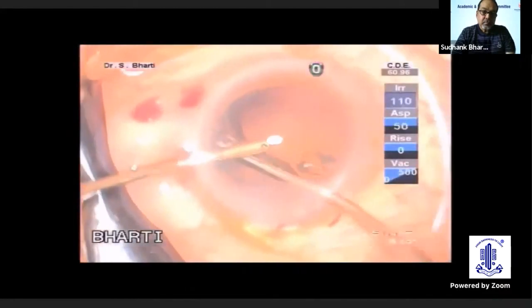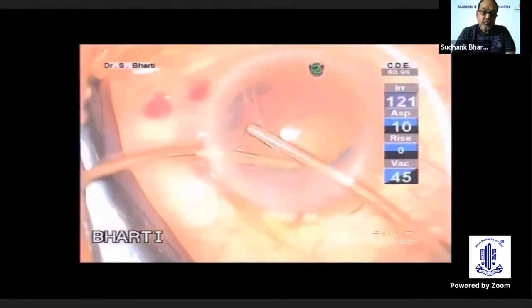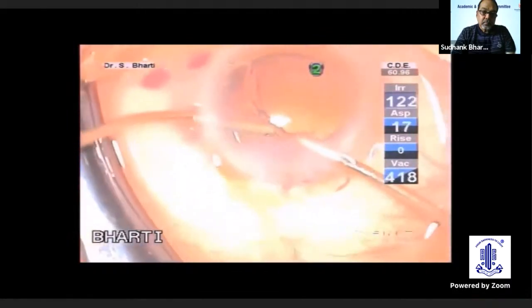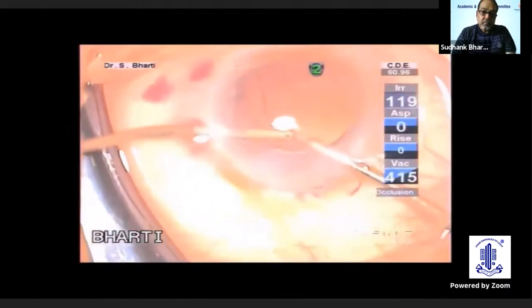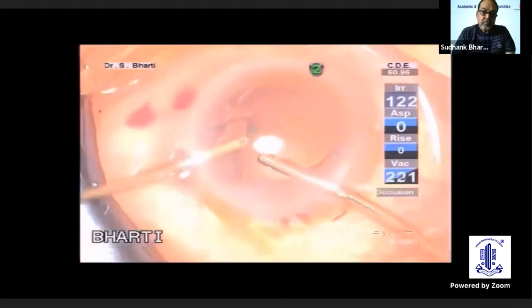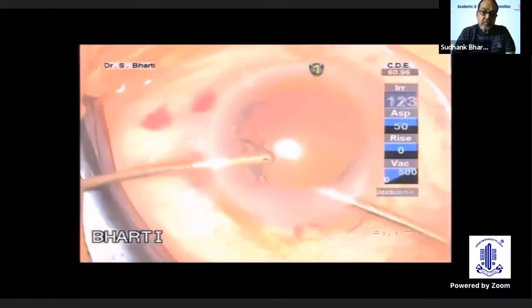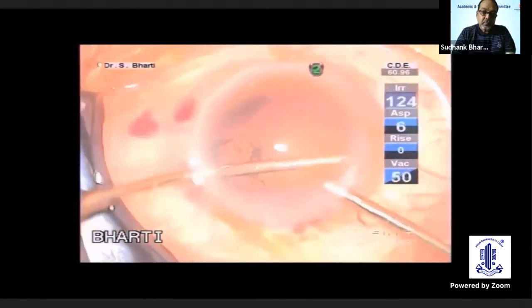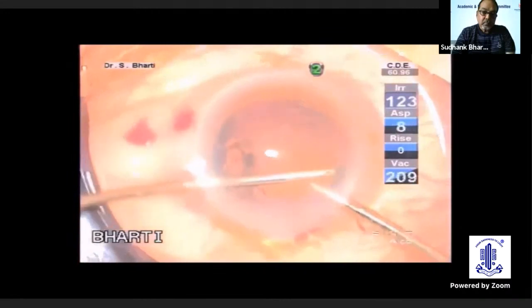In a large posterior capsule defect, as in this case, a structured disciplined approach is required to be implemented in these challenging situations. Maximum cortical matter is removed by aspiration. The retained cortical matter is the main cause of subacute chronic endophthalmitis and should be removed as much as possible.